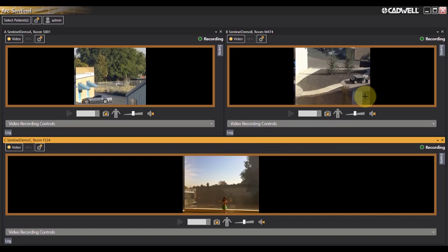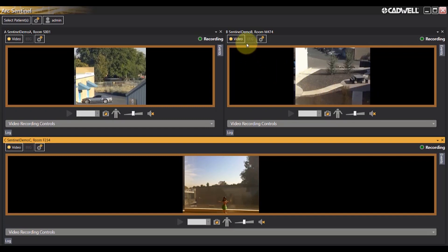If at any point you wish to view active EEG from this Sentinel monitoring screen, you can simply click on the EEG icon next to the patient's name.